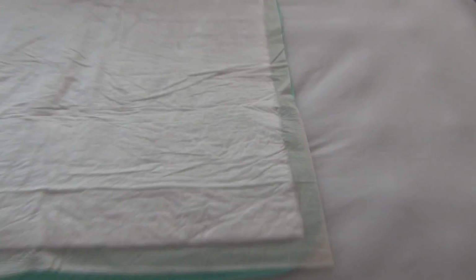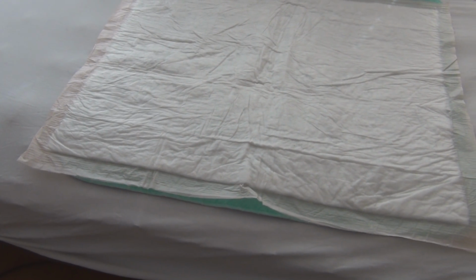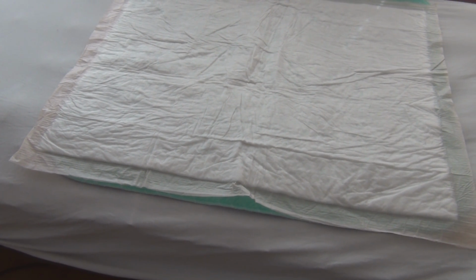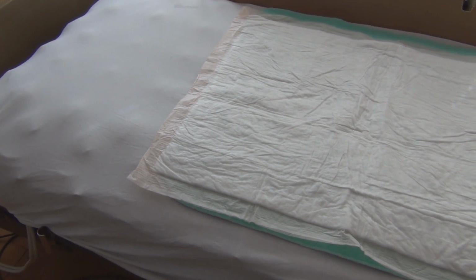And in addition, I always use these. These washable pads here are supposed to be washable, but I also have these disposable pads for accidents, quick cleanup. And I just realized that the flat width and length of this are going to be longer, and it's going to seem like it doesn't fit, for this particular case, a twin mattress. But as this inflates, those dimensions will shorten up, because as these chambers fill up, it pulls in the length and the width.